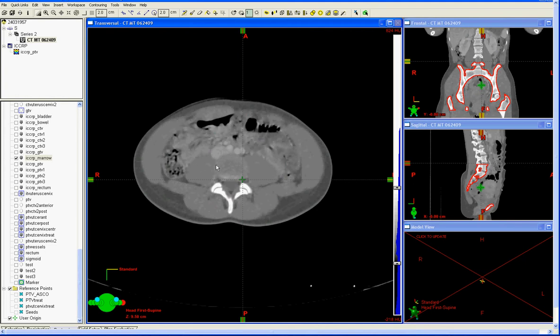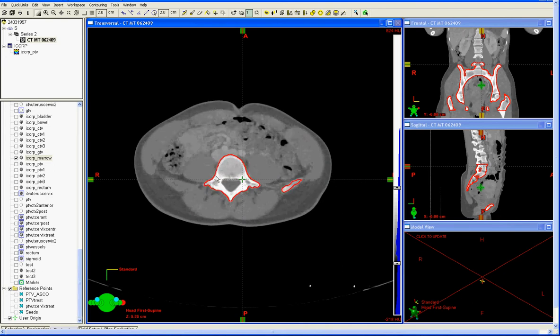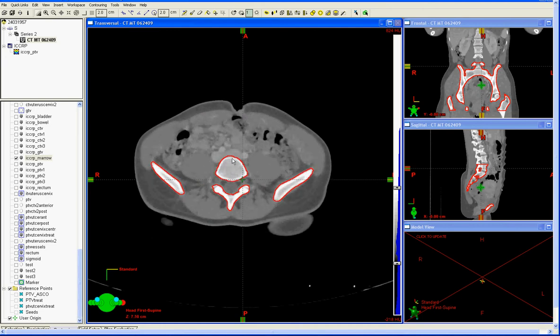We're looking at the simulation scan at the level of the L4-L5 interspace. Proceeding inferior, we will see the first slice at the top of the L5 vertebral body. We recommend a contour around the outer boundary of the bone, including all of the interior structures as one contiguous structure. We do not worry about excluding interior structures that are entirely surrounded by bone, such as the spinal canal. However, when these are separated, you can contour the two bony regions separately.